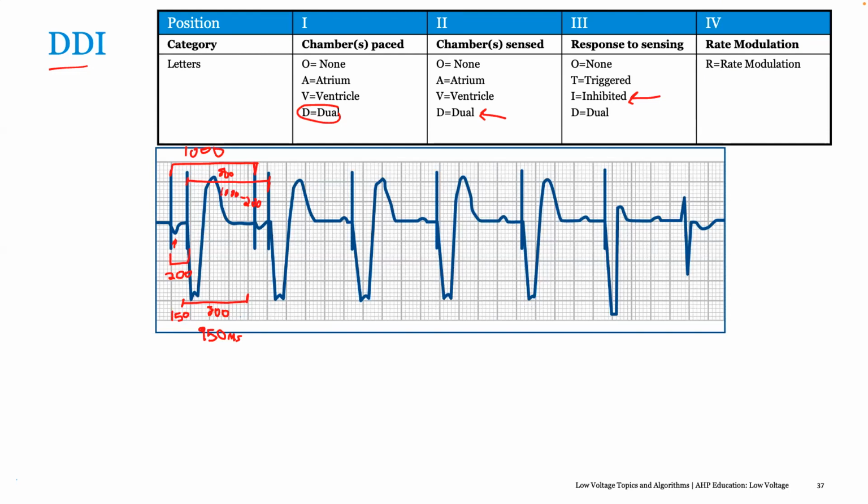So what do you recommend? What mode do you recommend most times to address this? Because if you review the patient before the procedure, you will decide which pacing mode you are going to give based on the intrinsic activity of that patient. What you saw on the EKG, and what we think is the intrinsic, the native activity of that patient.